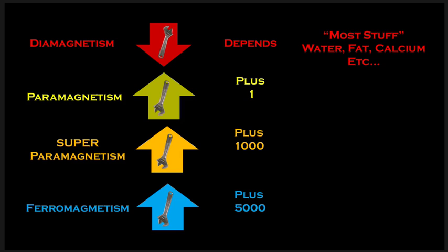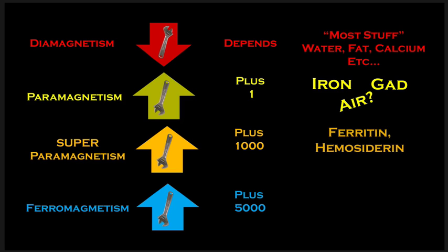Now, there is a minority of tissues in the body that contain accumulations of metal: copper, manganese, a little bit of iron, like maybe some red blood cells. Gadolinium actually works by being paramagnetic. Air, why would air be? Because oxygen actually acts weakly paramagnetic.